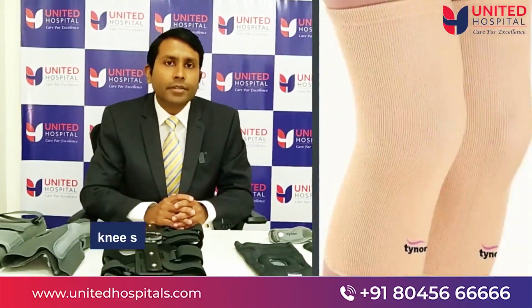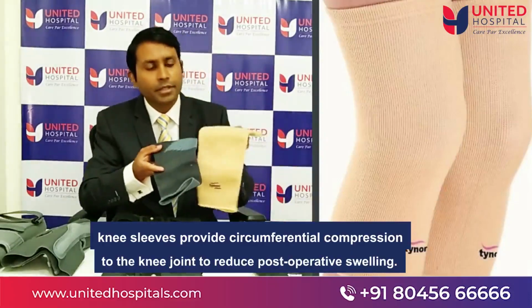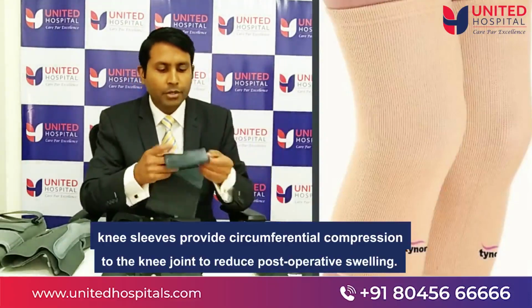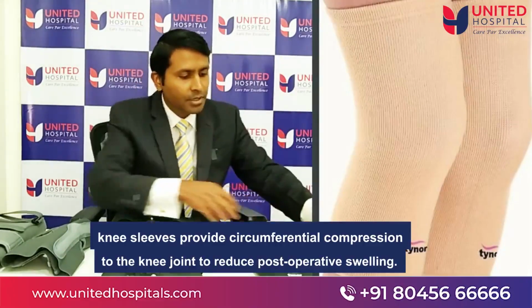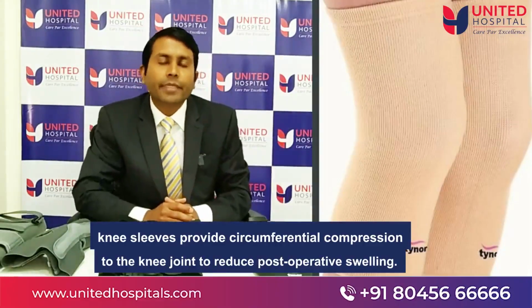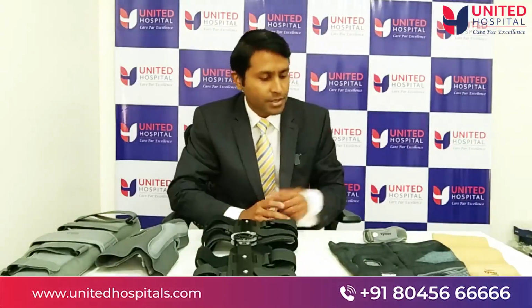The next type of devices are collectively referred to as sleeves, and some of the designs are here, and they are often made out of elastic material which provide circumferential compression to the knee joint, and thereby it reduces the swelling and also helps to provide pain relief to the patients.